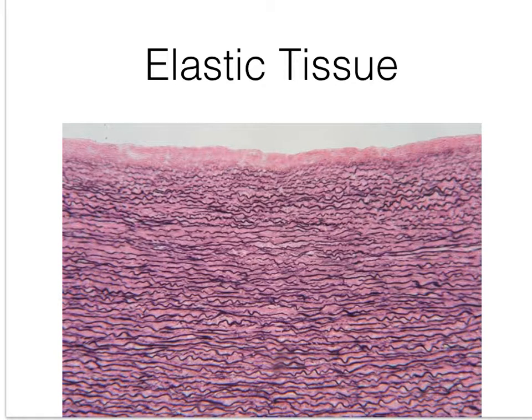This is a dense tissue, you can tell, because you've got lots of layers of these fibers on top of each other. You can distinguish it from reticular tissue because reticular tissue is not going to have the fibers in parallel bundles. There will be fewer fibers and more cells in reticular tissue. And you can see here that there are some cell nuclei, relatively flat and interspersed. Those are mostly going to be fibroblasts. So in this tissue, the type of cell that you would find is fibroblasts. The type of fiber that you find is predominantly elastic fiber.